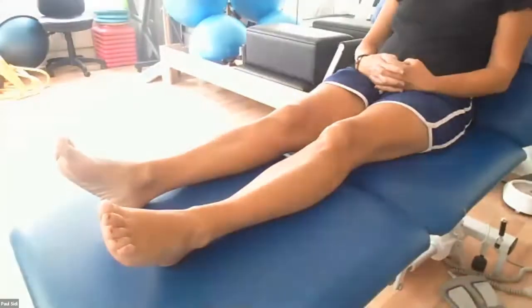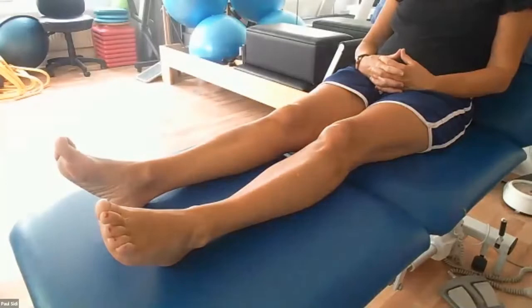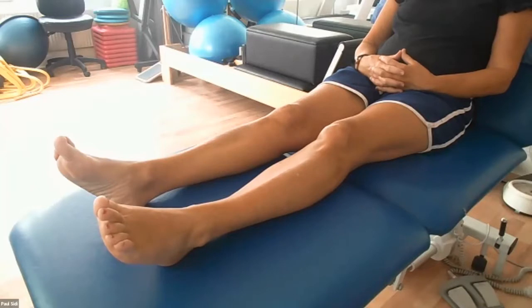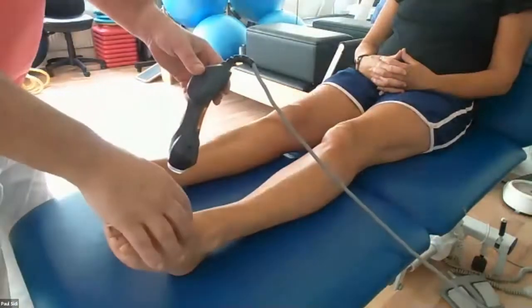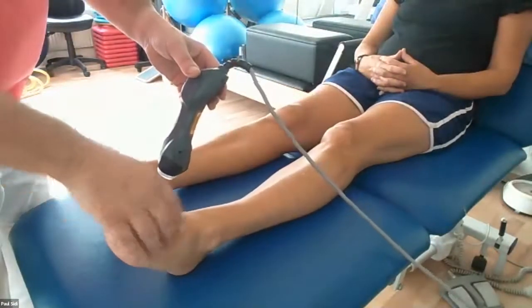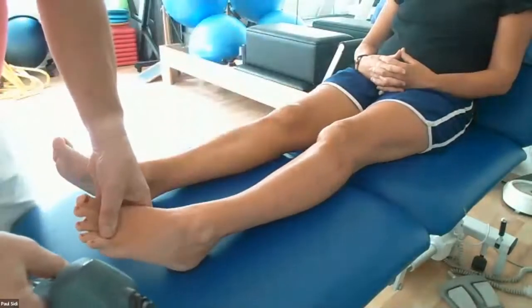So we're back with the patient. Let me just check my settings. I did the foot arthritis. What I have done as well is I put the CPW on here. So I'm chucking in high power, and it's very simple. Which was the foot we were treating? Okay, we're treating that one. We're coming in all this area around here. What I said was try and get them to put the foot down and bring it in a bit.